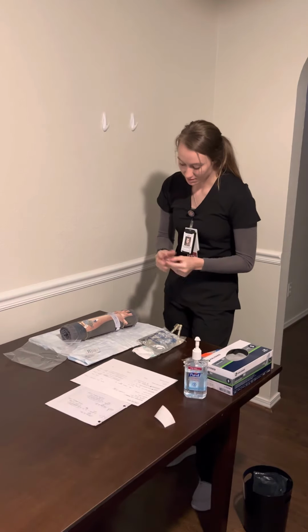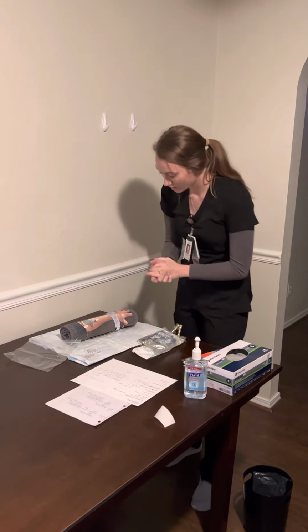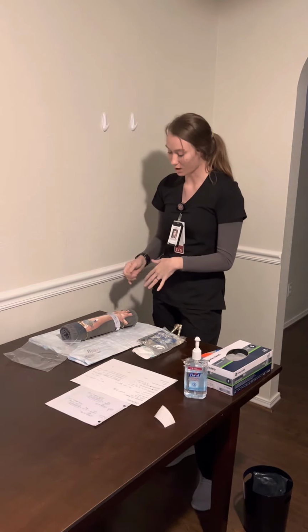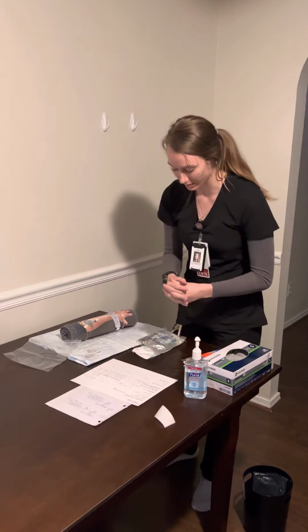She's going to tell me Davis Ellen, 9/19/1965. I have here Davis Ellen, 9/19/1965. Do you have any allergies? She's going to tell me pollen, but there's no known drug allergies, and both of those match her armband and my MAR that I have.